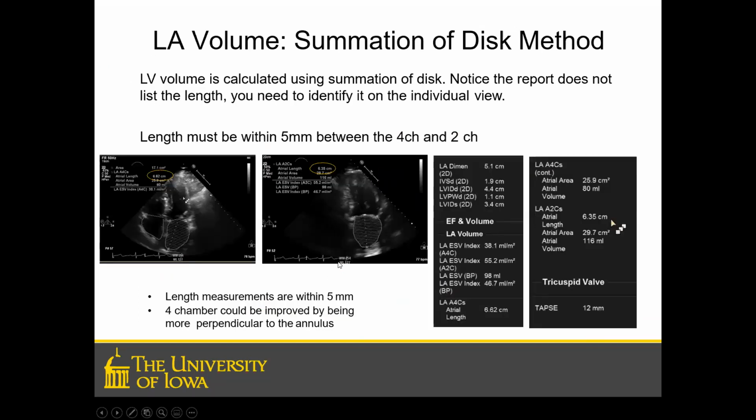All right. Again, these are pretty good measurements and just showing the comparison. So on this side, the 4-chamber is 6.62 centimeters and the 2-chamber is 6.35. So their two lengths are within that 5-millimeter difference, which is what we strive to do.